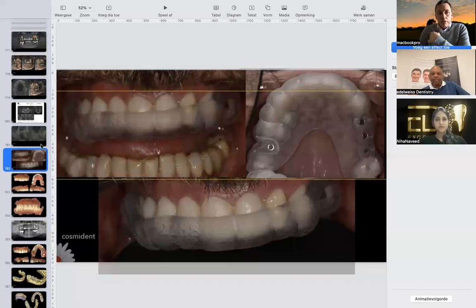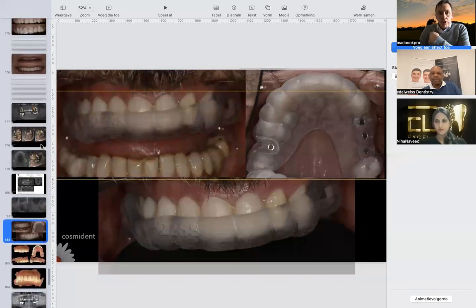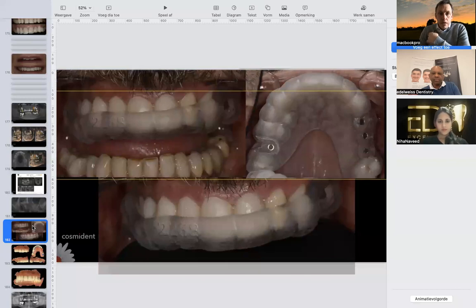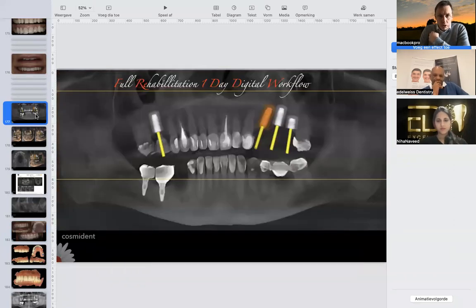You could go for veneers for the upper anterior. That's another choice. It's not a bad choice. In this case, you could go for that. The only reason why we did it here is because there were also big fillings in his teeth. If you look at the old restorations, you see that he already had a lot of big restorations. The reason why we went for a full, we call it not a crown, we call it a full contour, is because we wanted to cover all the old restorations. That's the only reason why we did it.